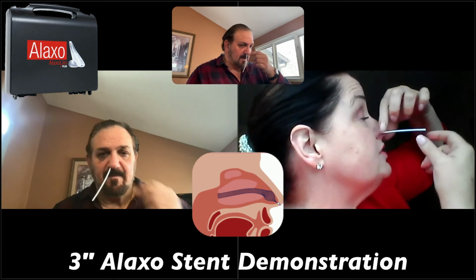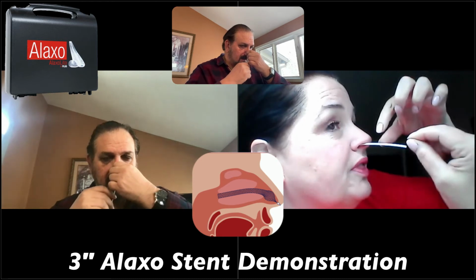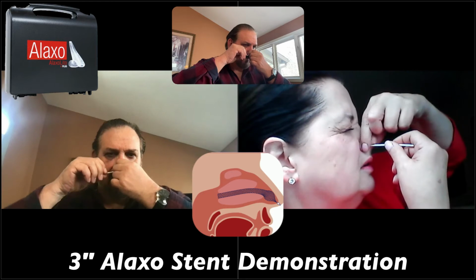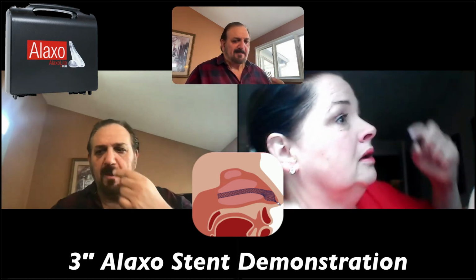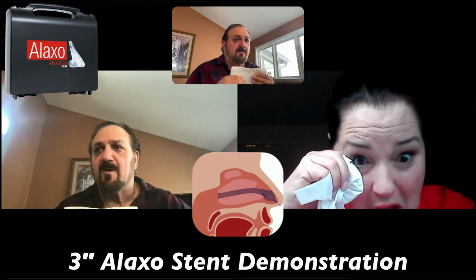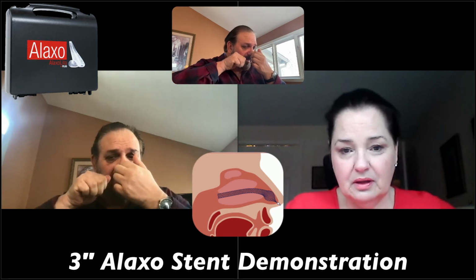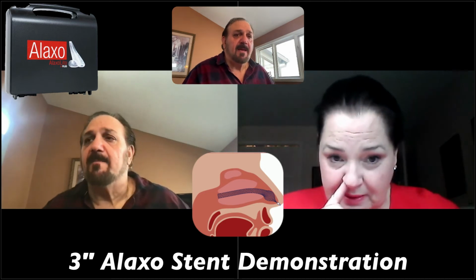And then you can pinch your nose, because the idea is that you want to pinch that end where the little silver ball is with that hole so that you can get it off. So there. I got it. It's from wiggling it around in your nose. Yeah, I got it. I can see when you press this down, it stabilizes it. So when you go like this, it just pulls off. Yeah, it pulls off. Okay, I got it.